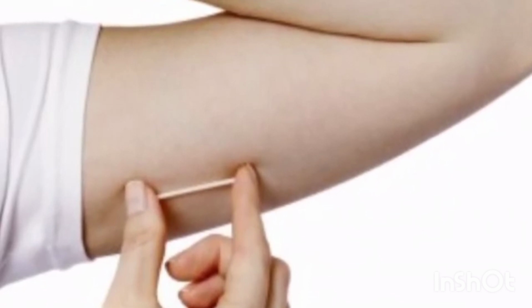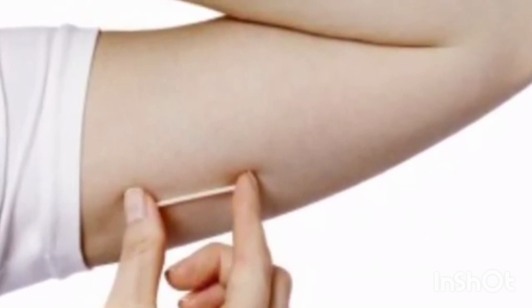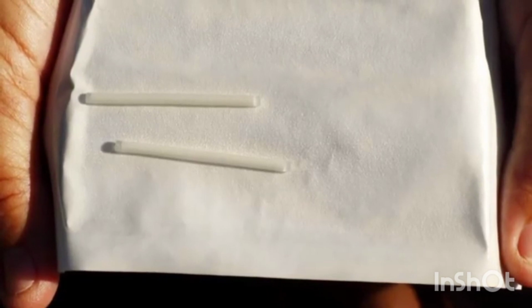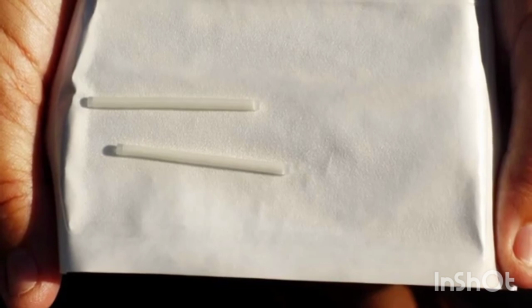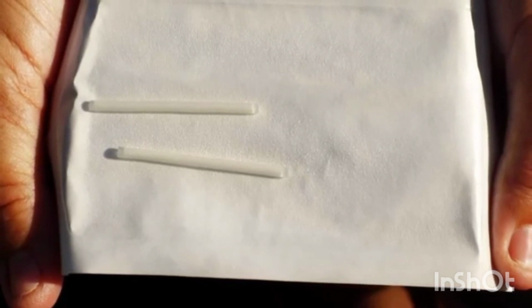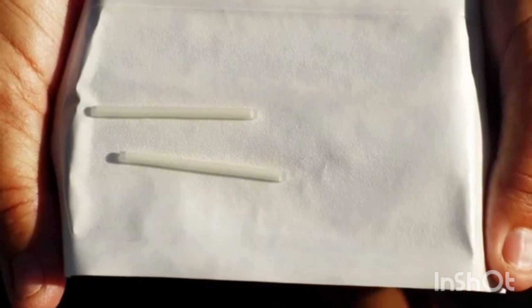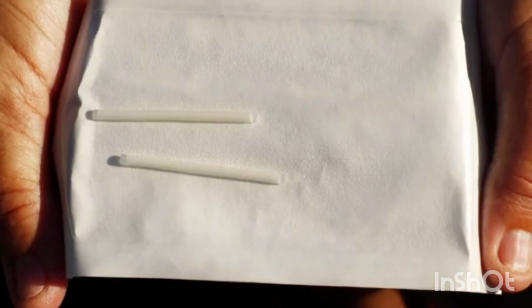Jadelle implants are indicated for the prevention of pregnancy and are a long-term, up to 5 years, reversible method of contraception. Both implants must be removed by the end of the 5th year. New implants may be inserted at that time if continuing contraceptive protection is desired. Following removal, fertility rates return to levels comparable to those in a population of similar women using no method of contraception. Jadelle is likely to be less effective in obese women.